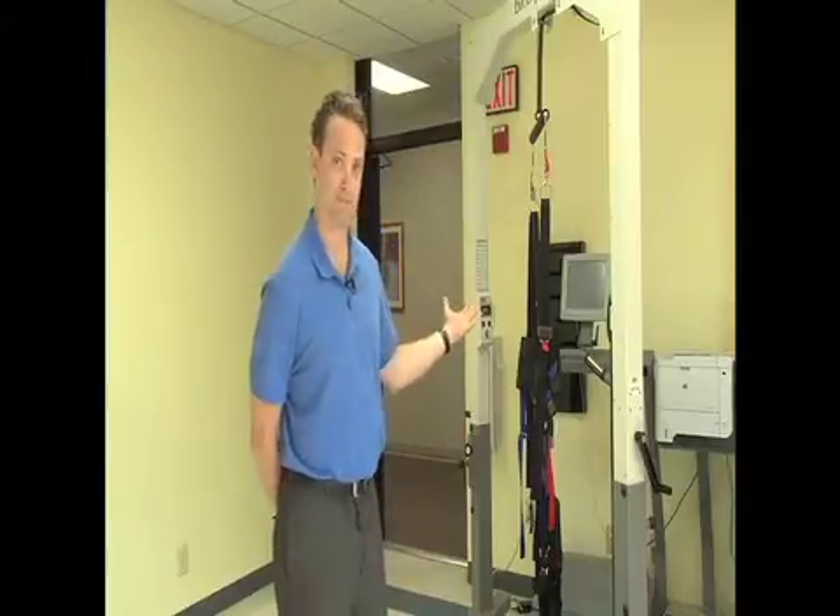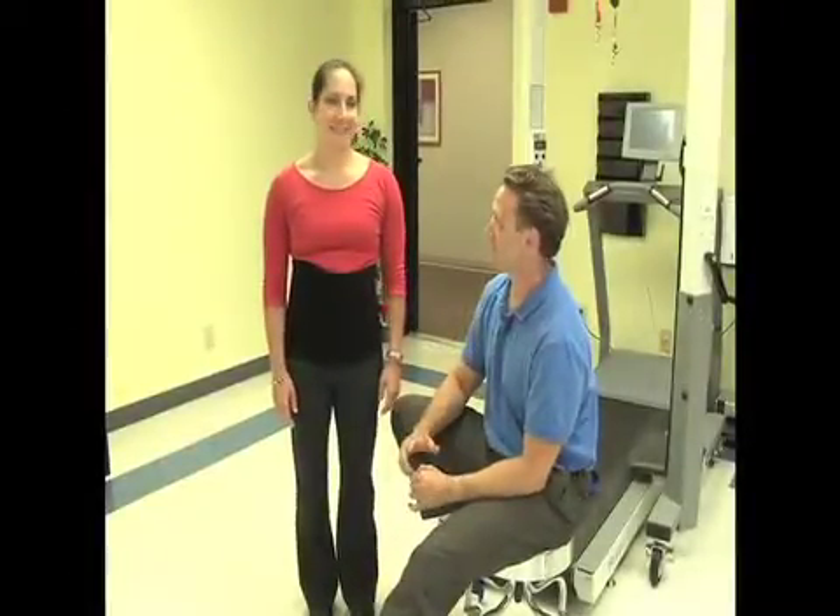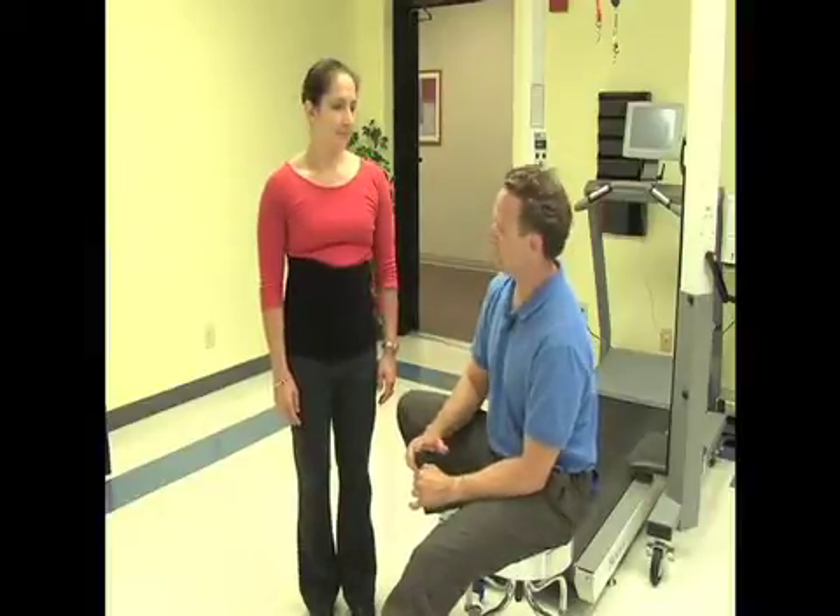Hello, my name is David Wilcox. I'm a clinical education consultant for Biodex and by training an occupational therapist. Today I'm here to show you how to properly apply the unweighing system harness in preparation for body weight support treadmill training on Biodex's unweighing system. This is my colleague Kate and by training she's a neuro certified physical therapist and today she has volunteered to be my assistant in the application process.